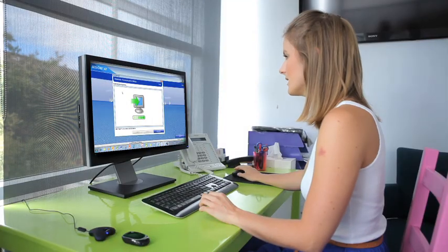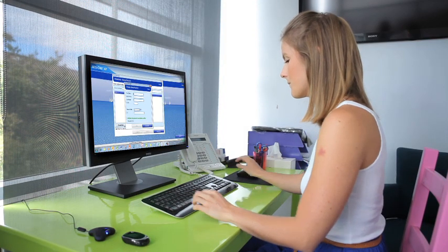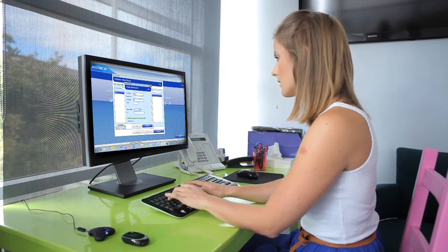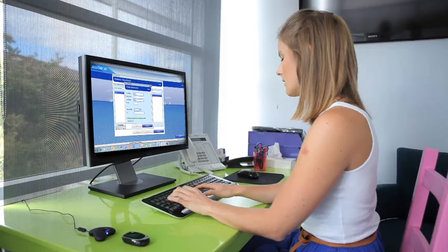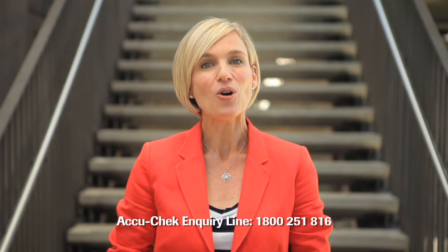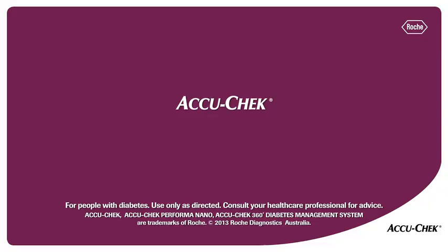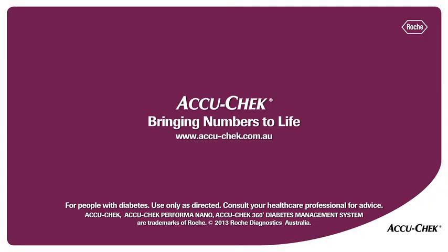With the help of the AcuCheck 360 Diabetes Management System, you can have the confidence to better manage your diabetes on a daily basis. To learn more about the AcuCheck 360 Diabetes Management System, refer to the help system, watch more topics of interest in the links provided, or contact the AcuCheck line on 1800 251 816. AcuCheck — bringing numbers to life.